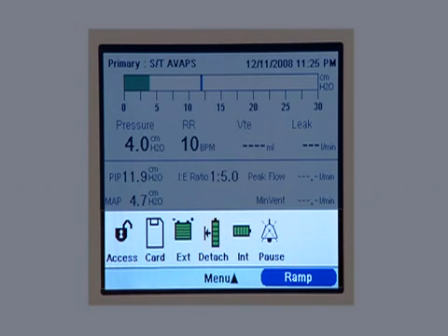You know the detachable battery is in place when you see this symbol. Here again, the amount of green shading gives you an idea of how much charge is left in the battery. The internal battery is indicated by a horizontal symbol. You can tell that this battery is fully charged because the symbol is completely green.